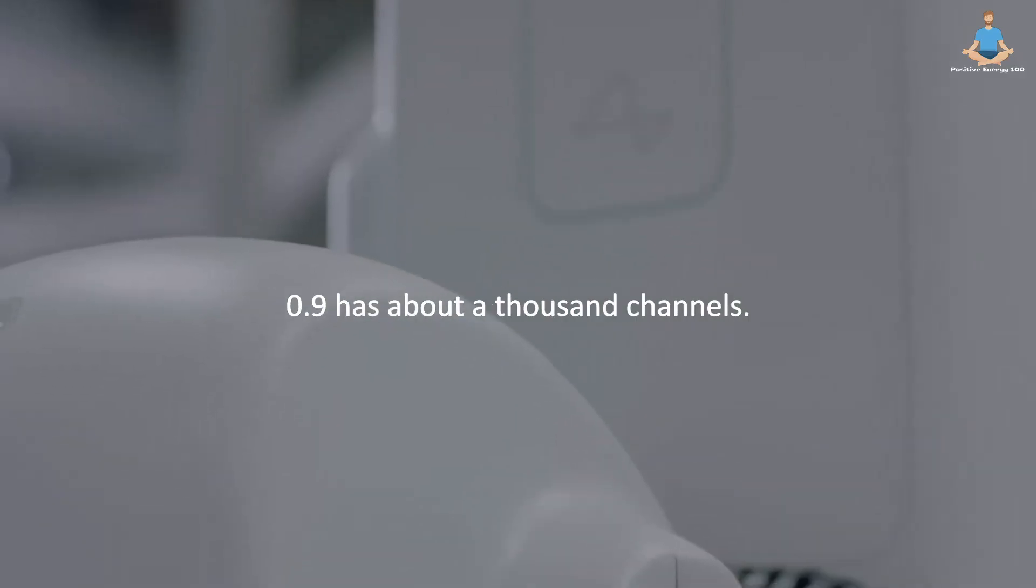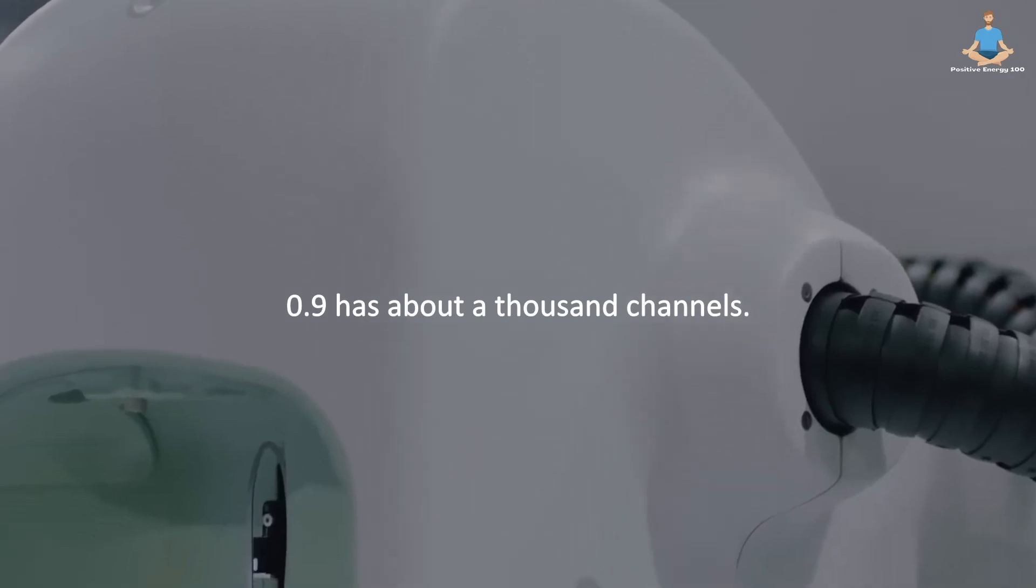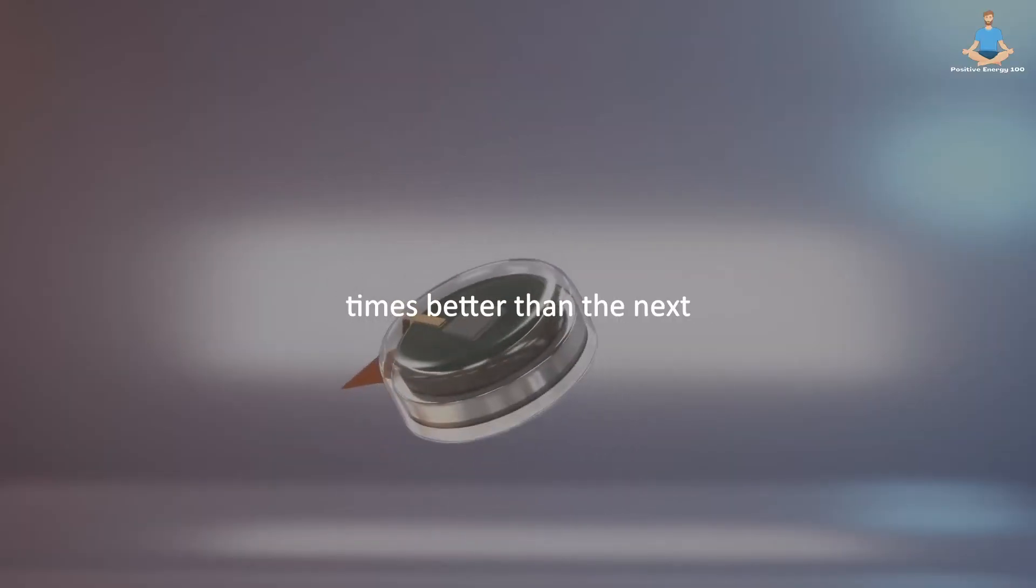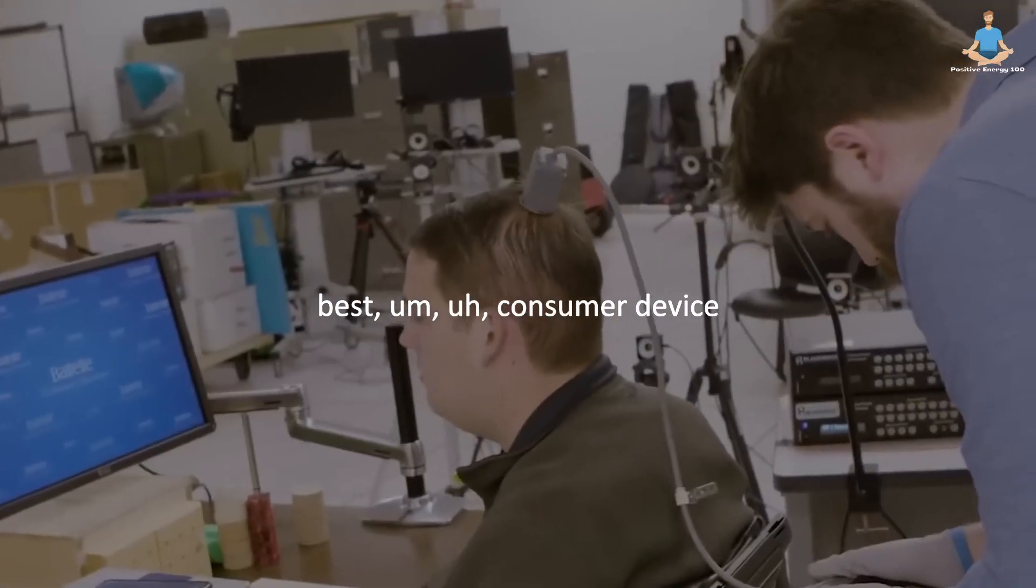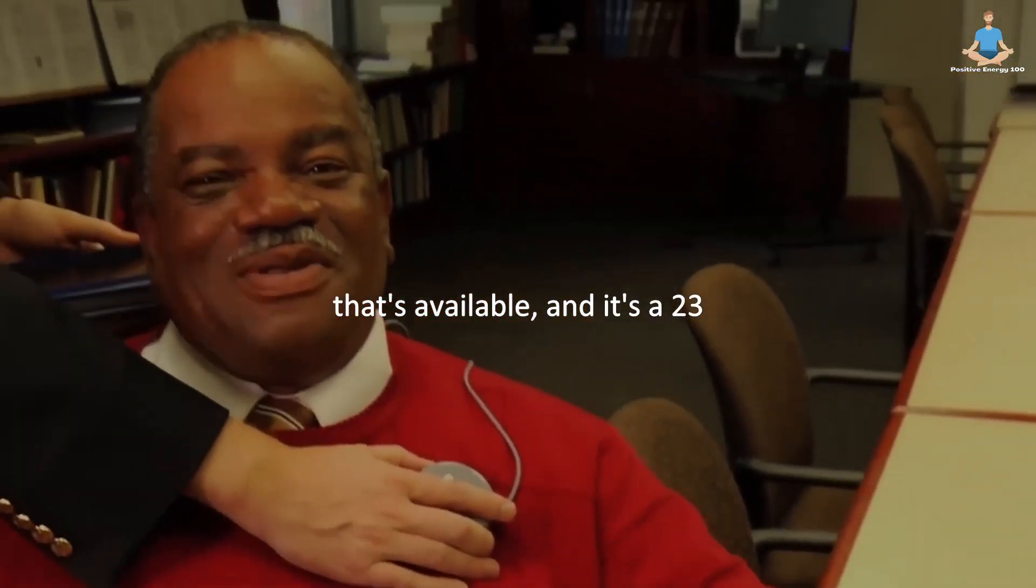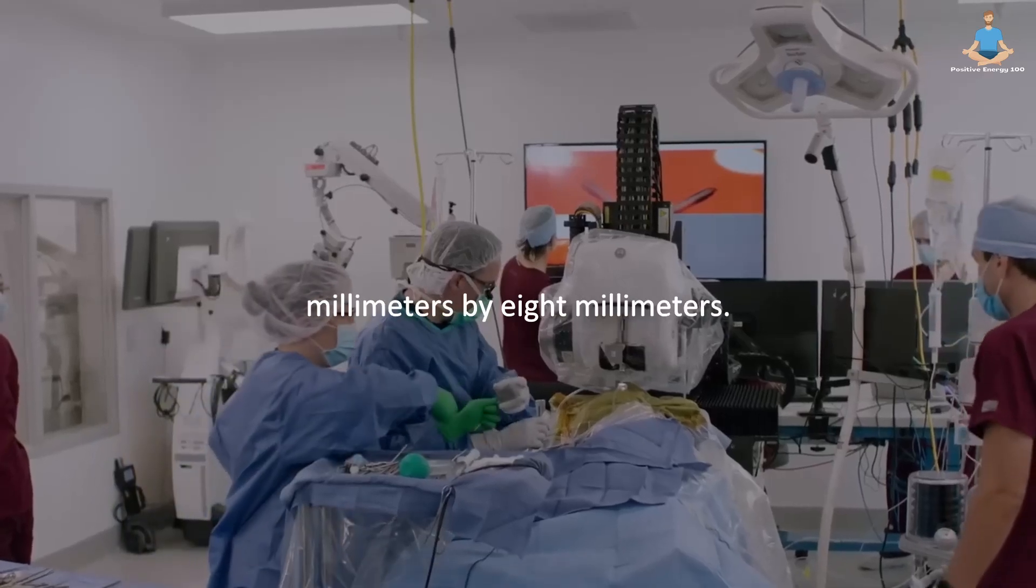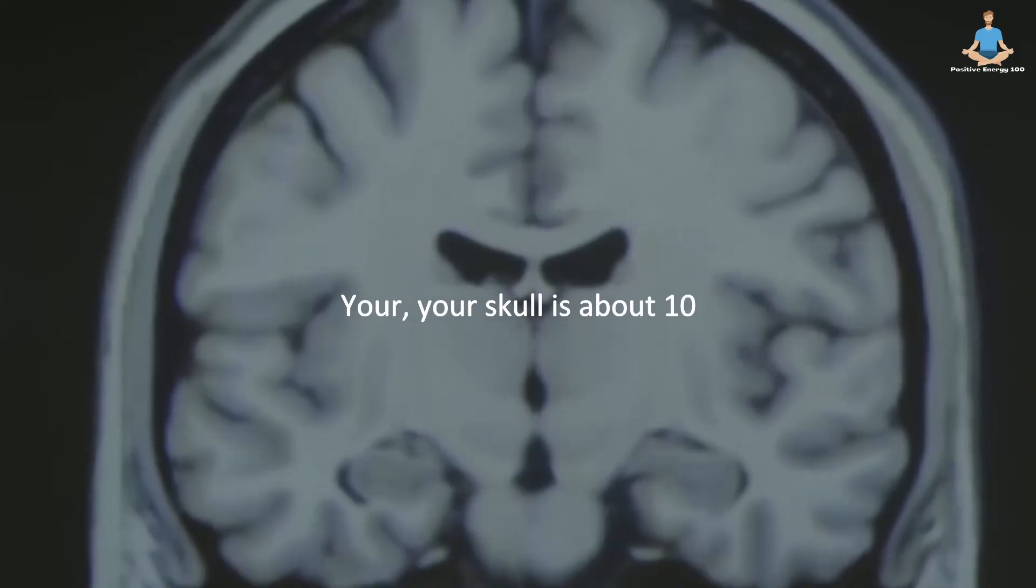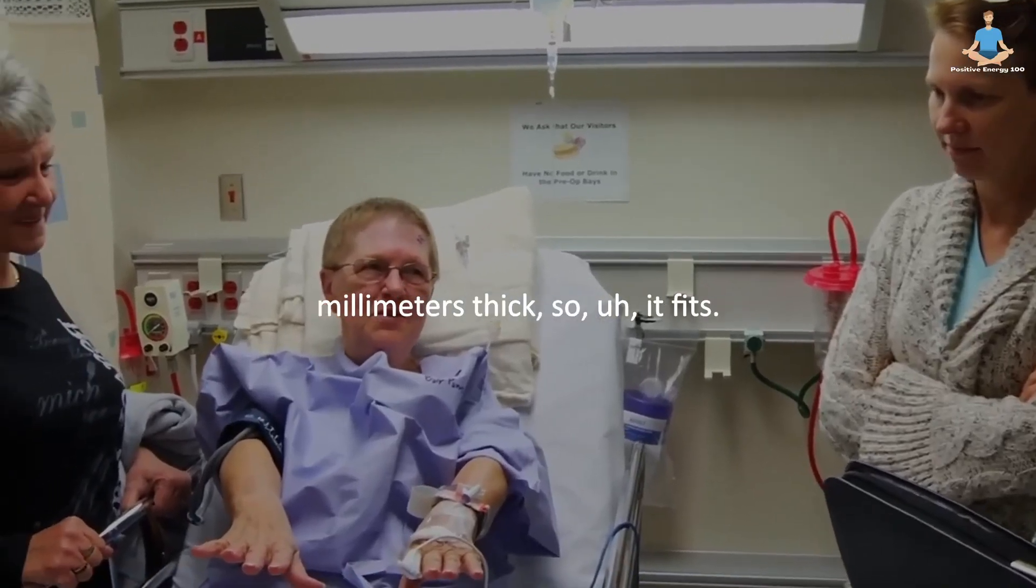Our current prototype version 0.9 has about a thousand channels. So that's about a hundred times better than the next best consumer device that's available. And it's 23 millimeters by 8 millimeters. It actually fits quite nicely in your skull because your skull is about 10 millimeters thick.